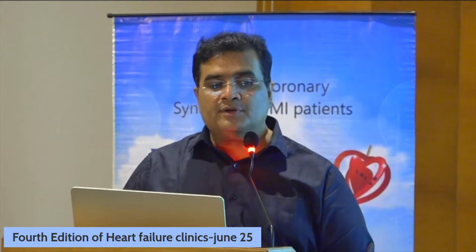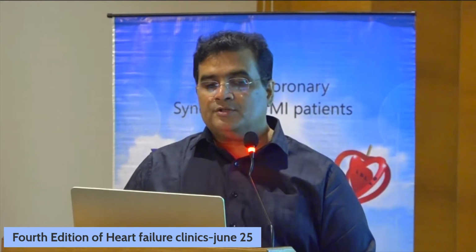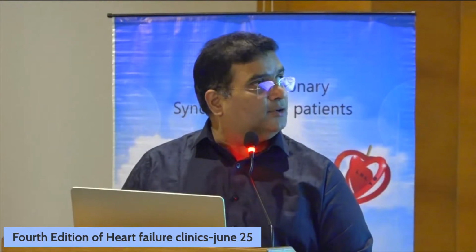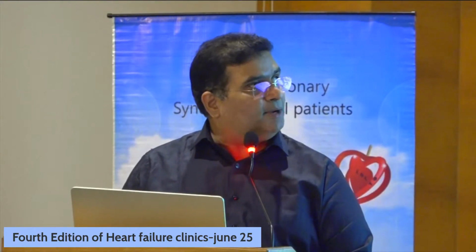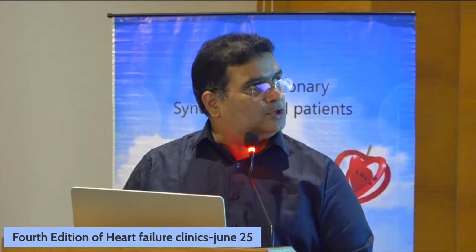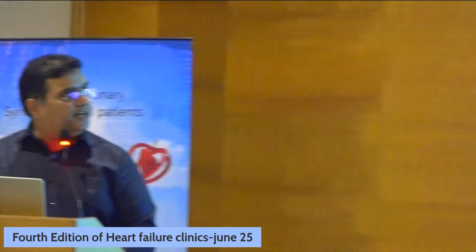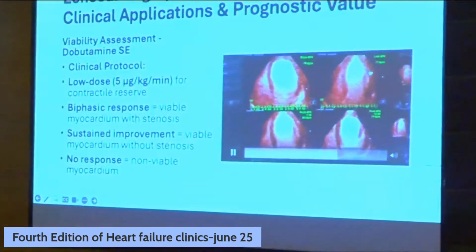Similarly, we can look at the dobutamine stress echo also. We can look at various views. This is the basal one. You can see the cursor here. You can see the basal one, and at a dose of 10 micrograms, you can see the ventricle, you can see the endocardial border here. Here, endocardial border is decreased.